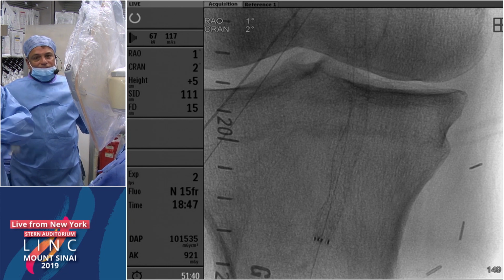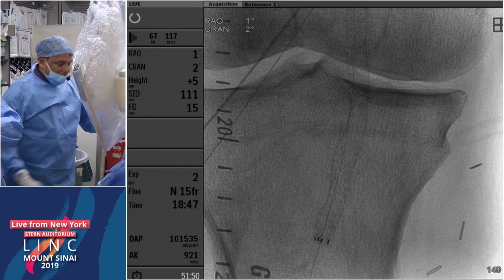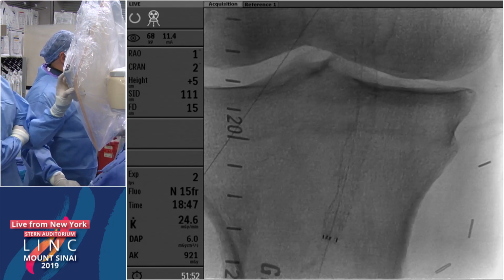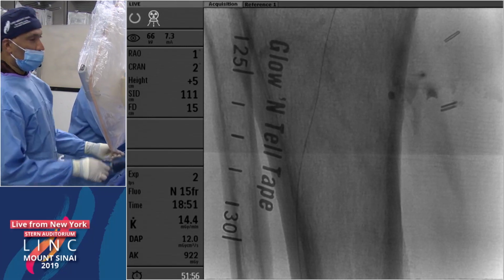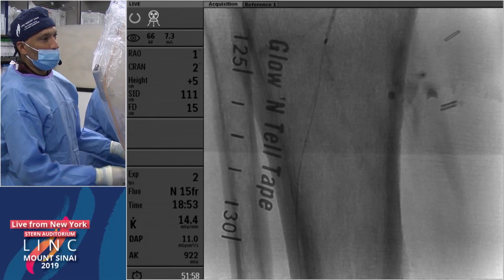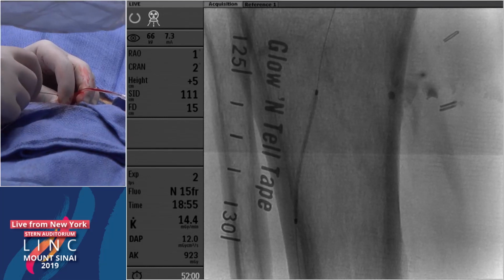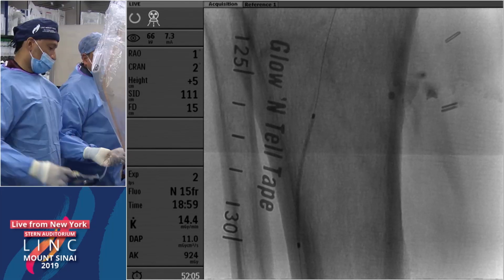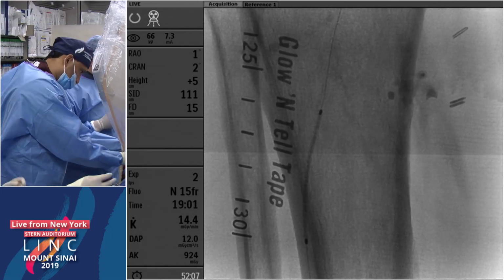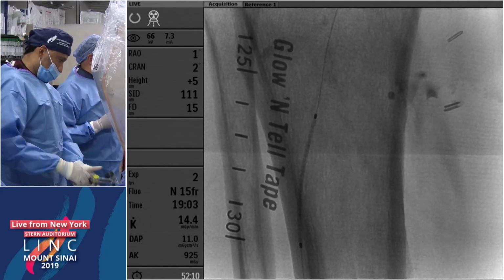Unfortunately, I did not feel comfortable with CLI and all these things. He's probably going to need to be on a NOAC as well as Plavix because of his high-risk status with his vasculature. So then after that, we just went ahead and ballooned the peroneal, as Stephen was suggesting, and I'm also interested to see what Fadi is saying. But I think that this posterior tibial artery in the foot is really quite diseased. So we're just going to try to increase our flow through this, and then see how he does.